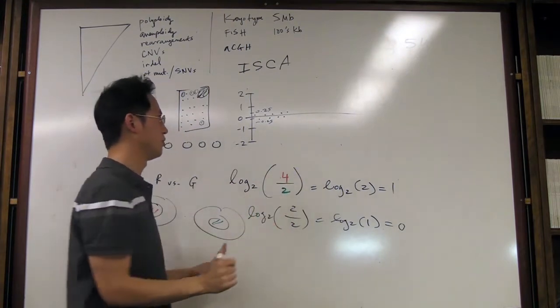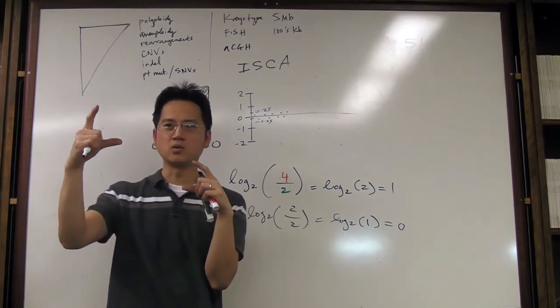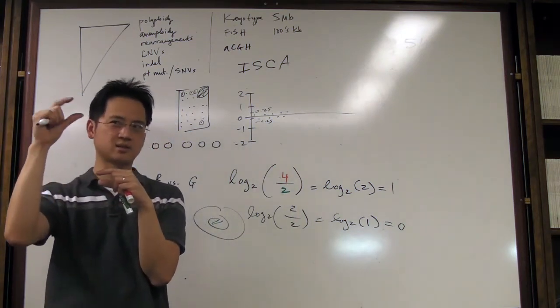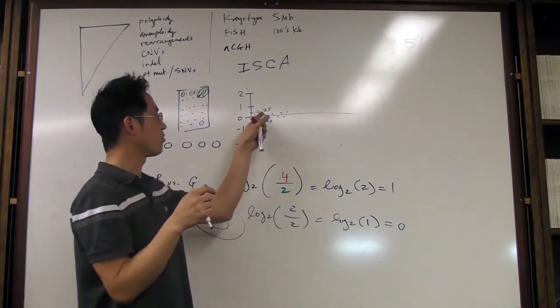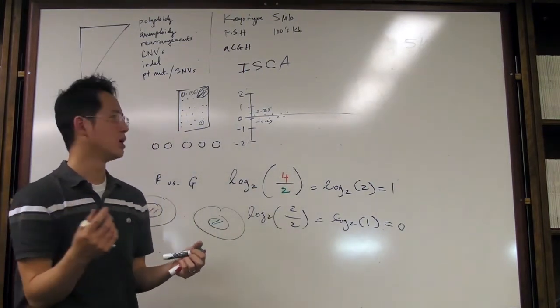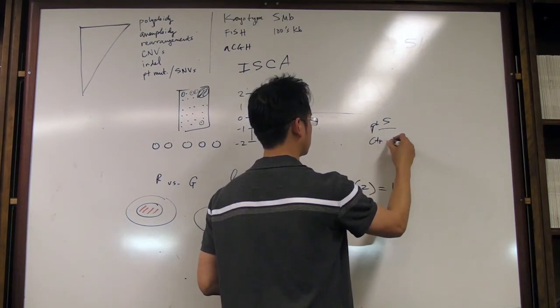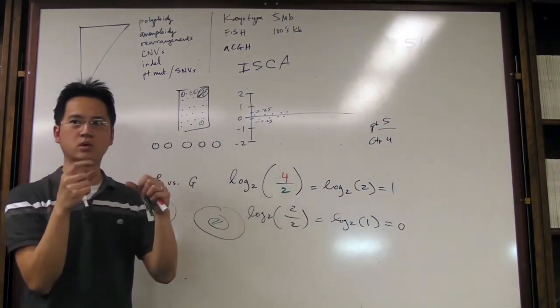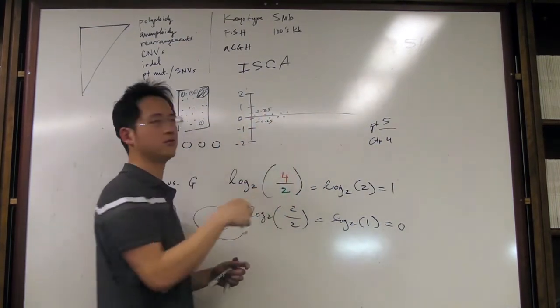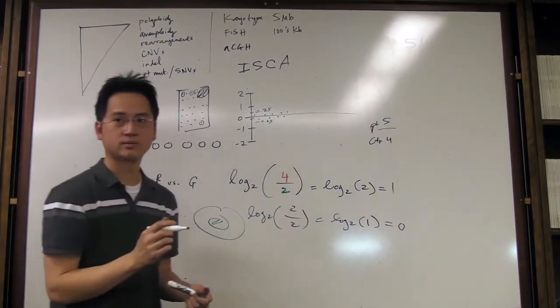Apologize for that. It's not 2 to the 0.25, but what it is that there's a certain level, let's say you have 1.2 of patient relative to 1 of the control. So it's not exactly a 1 copy gain, it's just maybe under a 1 copy gain. It will give you some fraction like this. It doesn't really make sense, right? When you talk about germline conditions, for example. Unless you have a situation where patient shows 5 copies of something and control shows 4 copies of something. Then you might have that kind of weird ratio. But anyway, we allow for some breathing room between this 0.25 number and minus 0.25 number to call something normal or copy neutral. So we'll color these black for right now.